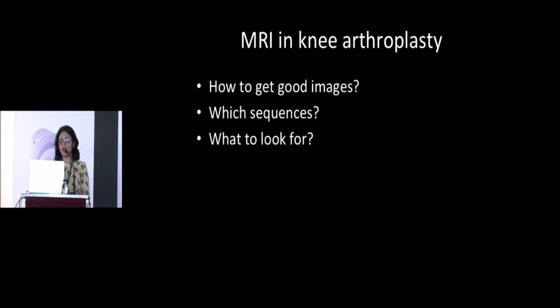So we've been doing a large number of arthroplasty imaging. I would say almost about 3 or 4 a week. And the idea is it's possible to get very good images. We take CT cuts in all these patients just because we don't know in whom we may still need it. But believe me, most of the times it's the MR which is providing us all the answers. There are very few times that CT has added something to it. X-rays we need to look at before we evaluate what is happening.